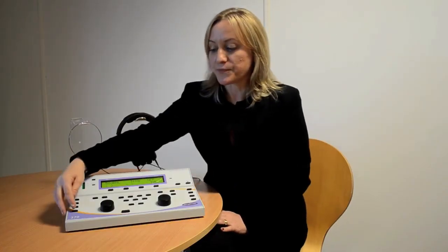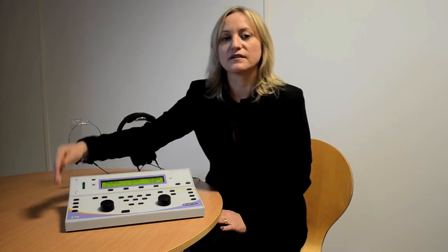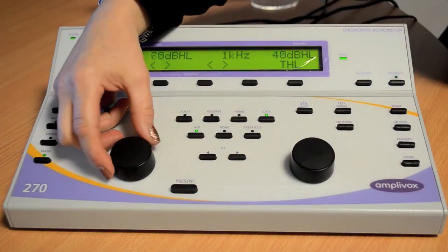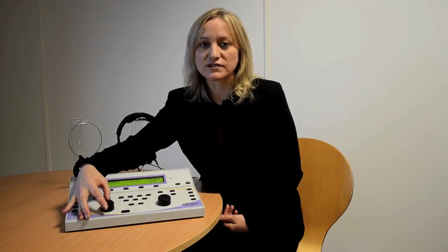If you require masking, press the masking button on the audiometer. Your second channel will be turned on and you can control that with the rotary dial. If you want to lock the masking signal, press the lock on the audiometer. Then when you change the decibel level, you'll notice that your masking signal stays at that locked level.